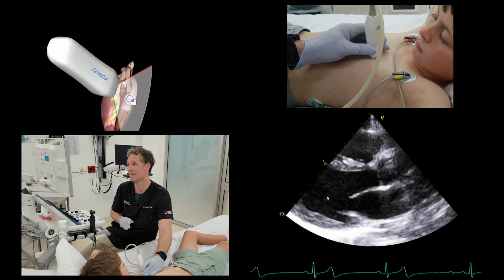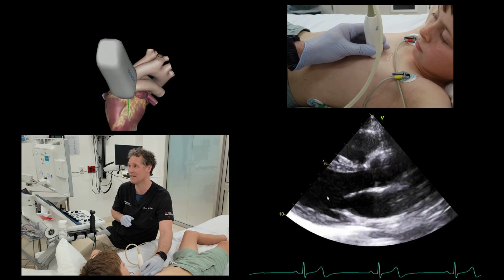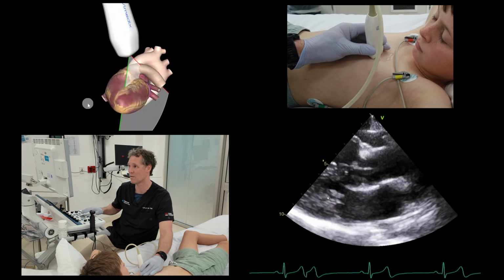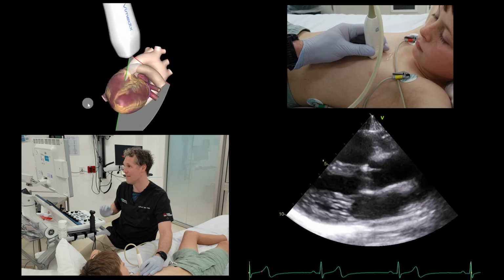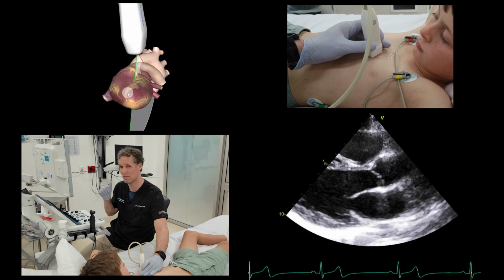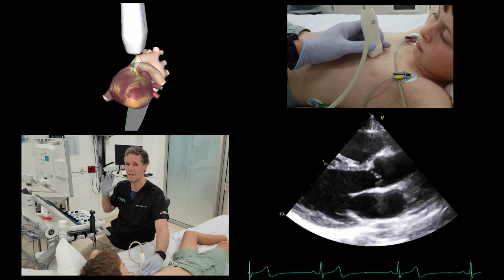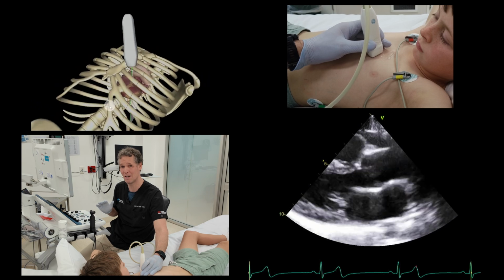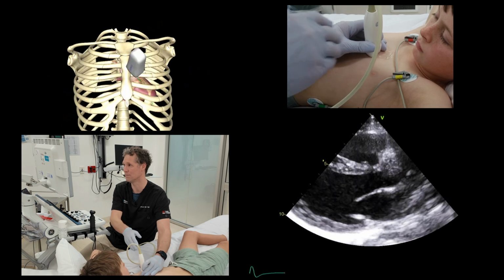I can. All right? I'm going to want to do little bits of fanning, little bits of heel to toe, just so what I'm interested in fills the screen, and I've got that left ventricle opening up into that ascending aorta. That's when I press store, and that's when I make my assessment. Have I got signs of LV dysfunction, RV dysfunction, horrible hypovolemia, signs of tamponade? And then I'm going to move on. You don't have to have amazing pictures to get that done, but obviously it helps. Okay? Okay, so next view.